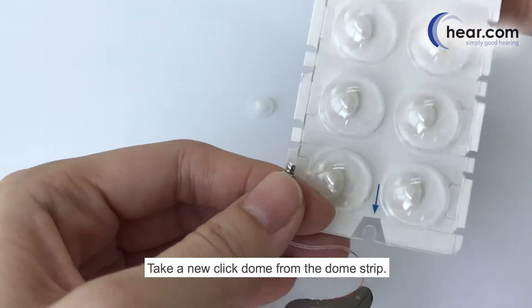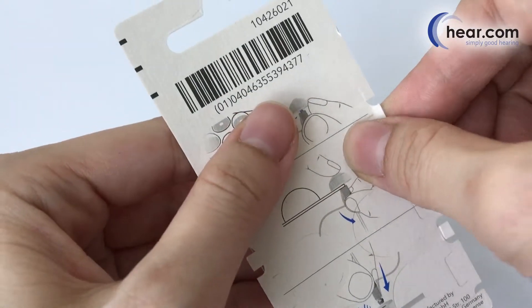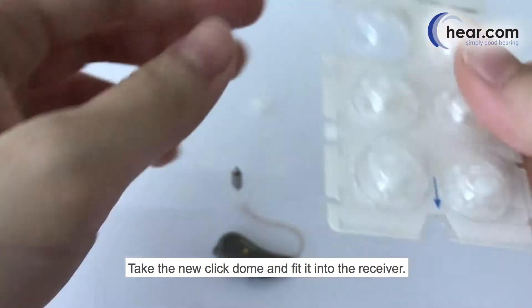Take a new click dome from the dome strip. Peel off the cover of the dome strip from behind. Take the new click dome and fit it into the receiver.